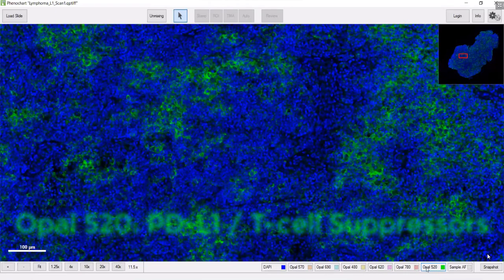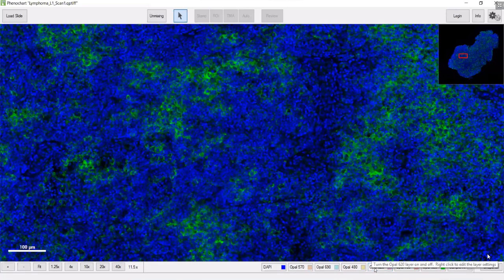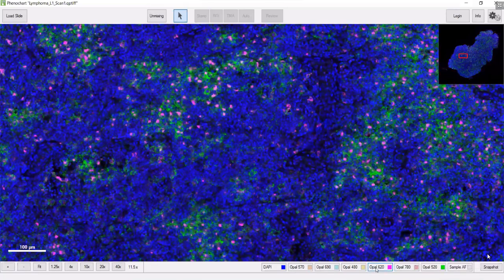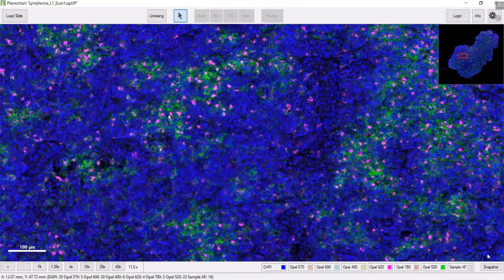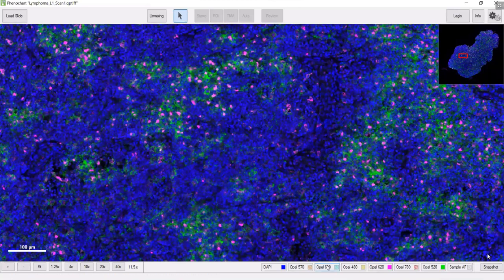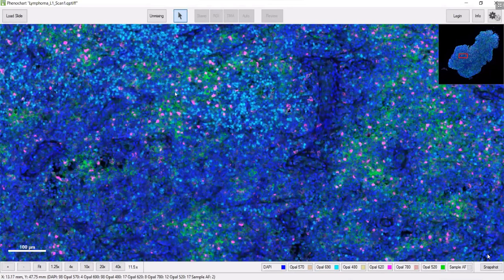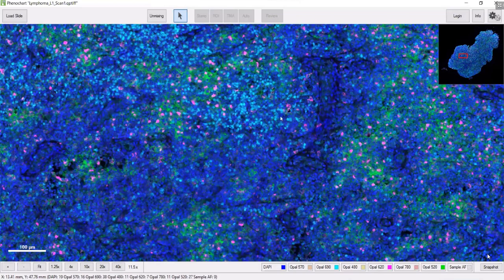By turning on other markers that are usually co-expressed in the same cell with PD-L1, you can see these are probably mostly macrophages and don't look to be tumor cells so much.